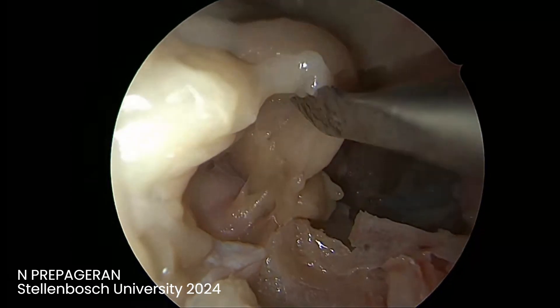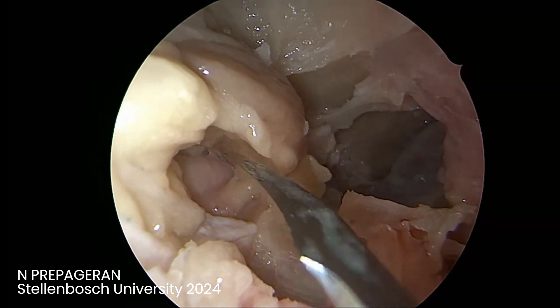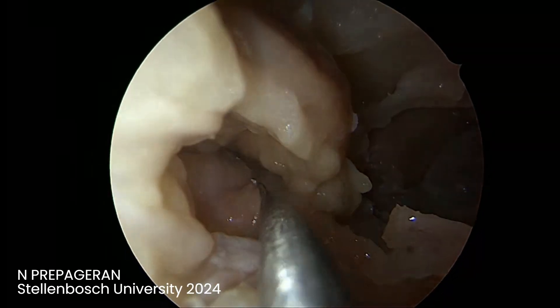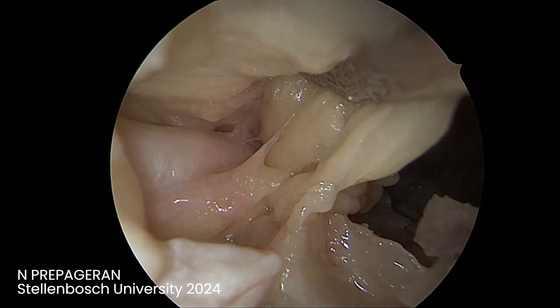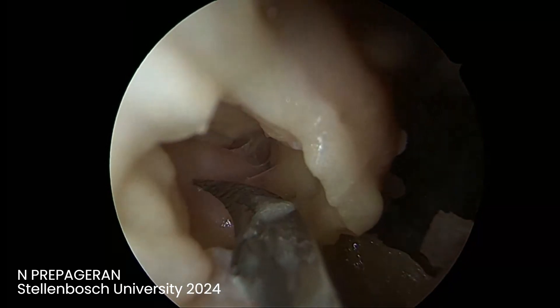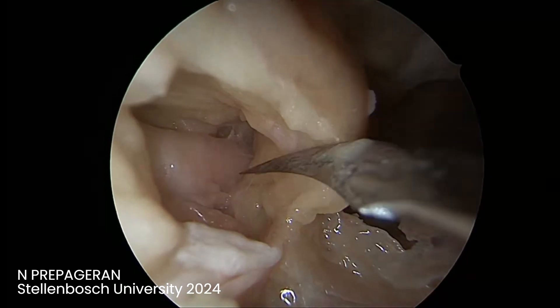This approach is more for tumors on the medial aspect, so the tumor literally protects the optic nerve. Can you see there is a membrane, a lining over the optic nerve? You preserve that — you don't damage this lining. As long as you don't damage this lining, you are safe and will never get an injury to the optic nerve.